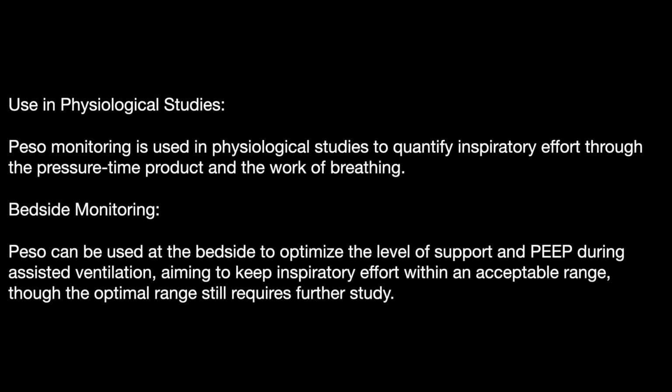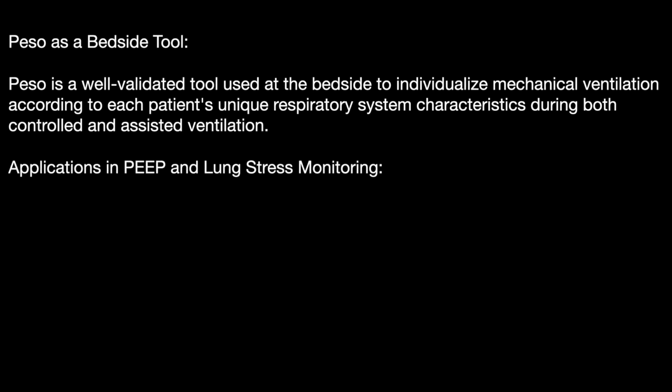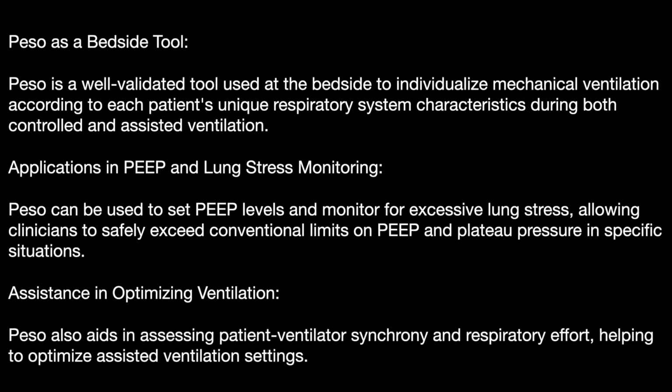For bedside monitoring, the esophageal pressure can be used to optimize the level of support and PEEP during assisted ventilation, aiming to keep inspiratory effort within an acceptable range, though the optimal range still requires further studies. It is a well-validated tool to be used at the bedside to individualize the mechanical ventilation according to each patient's unique respiratory system characteristics, during both controlled as well as assisted ventilation, for setting the PEEP as well as the tidal volume. And as we have already seen, it helps in reducing the asynchrony.